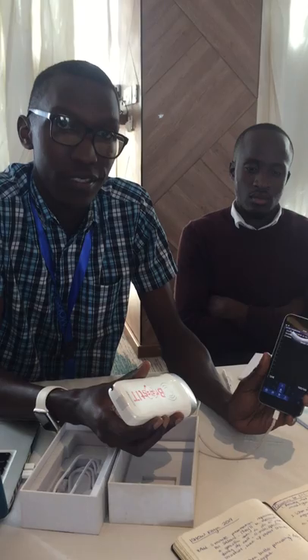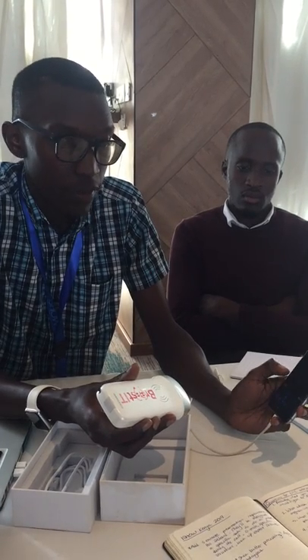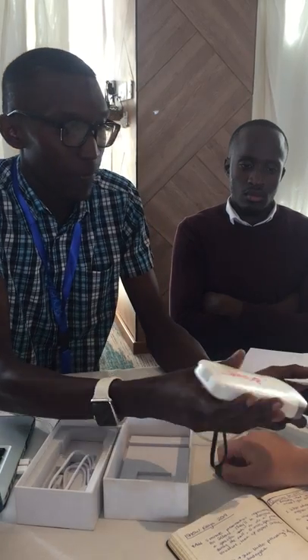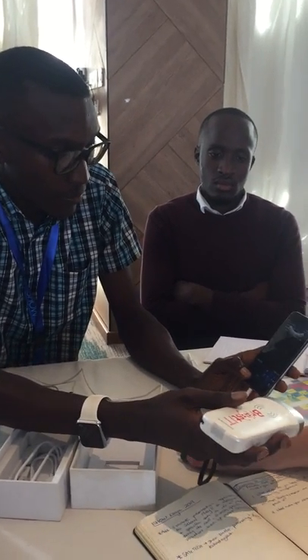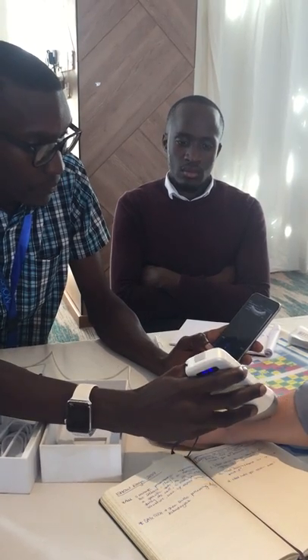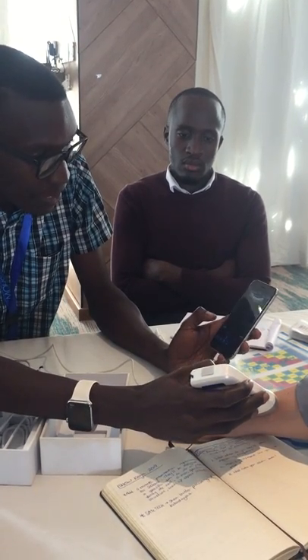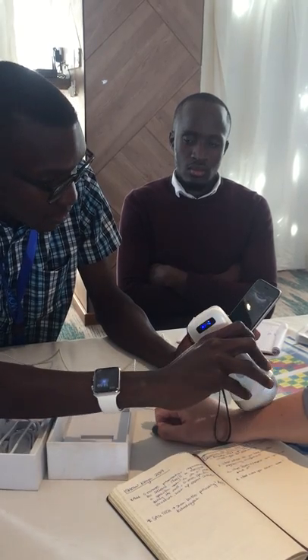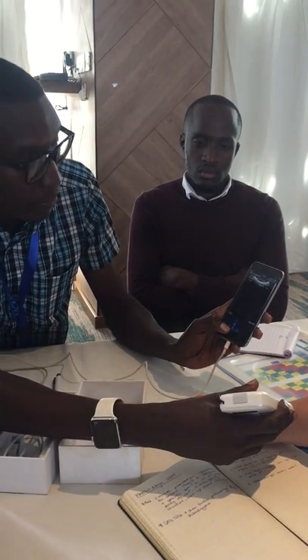So once you connect to your wireless network on the phone, you're able to start the scan. We don't have a gel so you can't really see a lot, but the figures are moving — that means it's really picking something up.